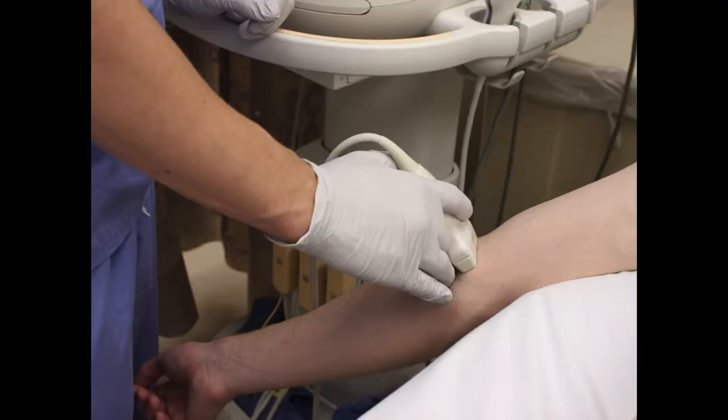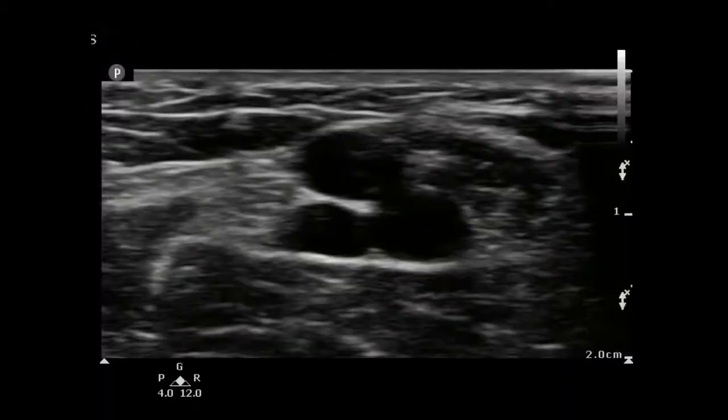When I'm evaluating a patient to see if their brachial veins are usable, this is where I'll put the probe, and I usually put it in cross-section as you see here. This is the ultrasound image that you'll see. There's a brachial artery, usually surrounded by two brachial veins and a nerve right next to it. It's important to identify all three of those structures because sometimes the nerve is right above the vein, and sometimes the artery is beside the vein like you see here. Usually, you're going to have the vein on either side of the artery.